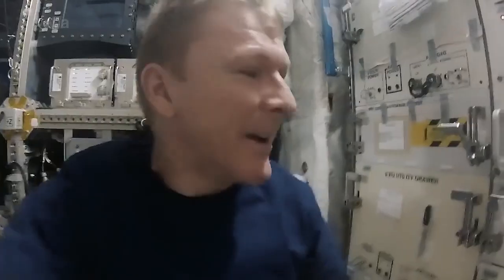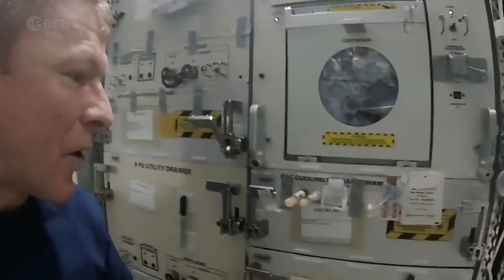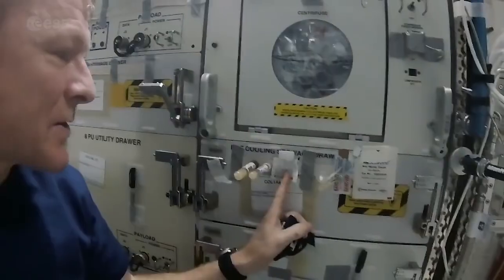Lots of the human physiology experiments that we do on board the space station need the astronaut's blood in order to collect the data. So this morning is one of the mornings I have to do self-phlebotomy and draw some blood — thankfully not too much this morning. The key to doing phlebotomy in space, I think, is good preparation, so I think I'm ready to go. I've got my sterile gauze there so I can clean my arm.